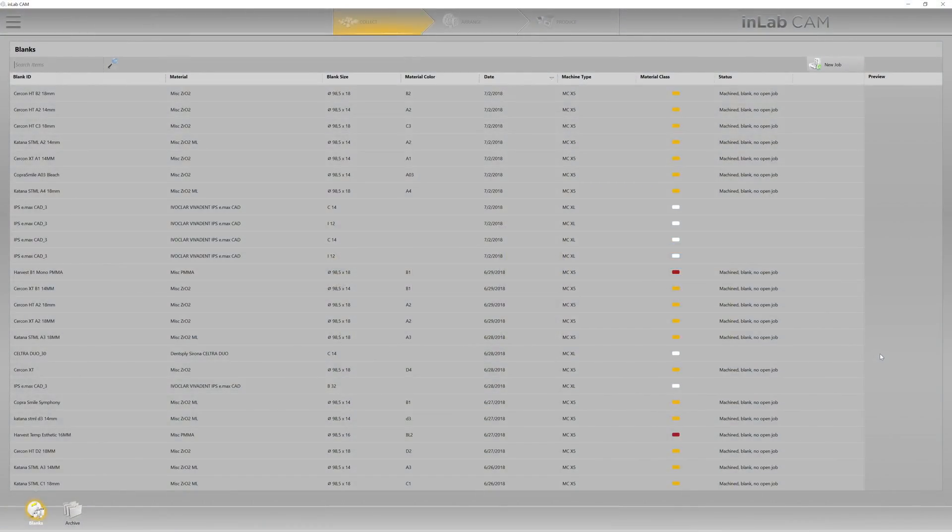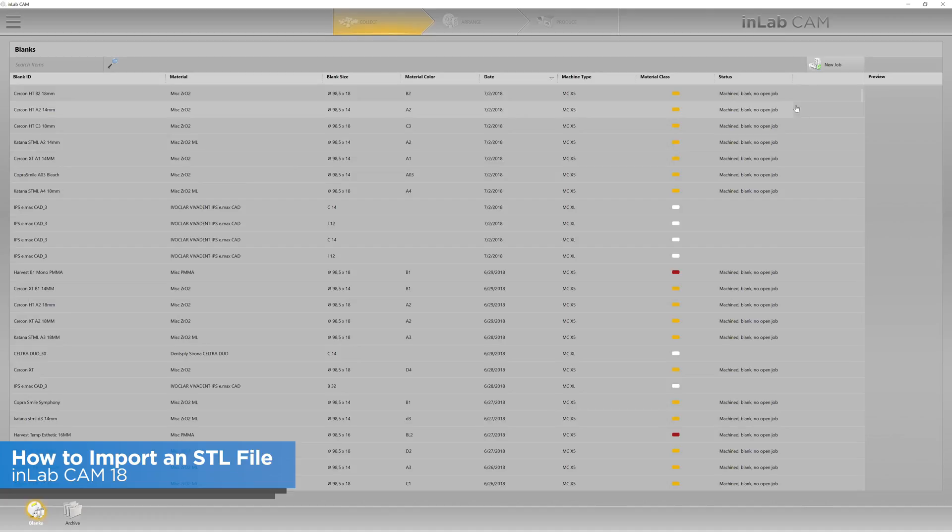Hello everyone. Welcome to Tekken 2. This is Michael Smith. Today we're going to bring in an STL file into our CAM software.